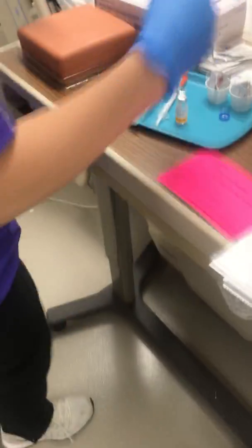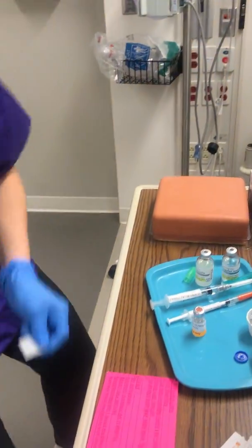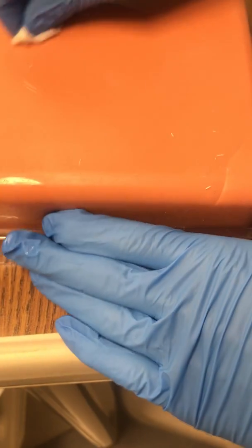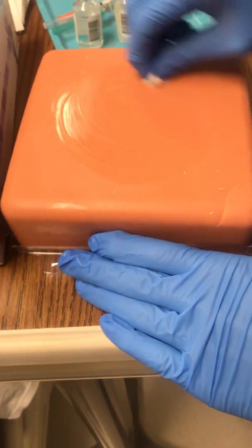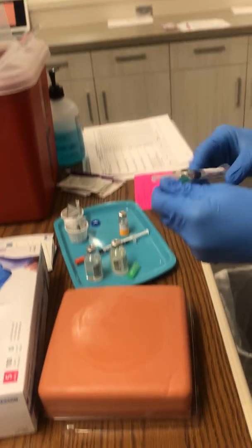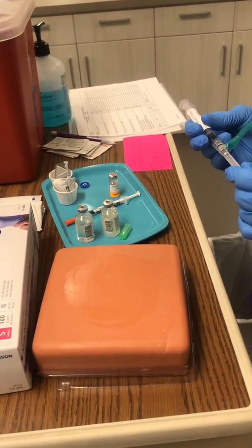And then discard that one. And then for the purpose of this video, we'll be doing it on the injection pad. So I'll clean off about 2 inches or 5 centimeters really well. And then I'll let that air dry.